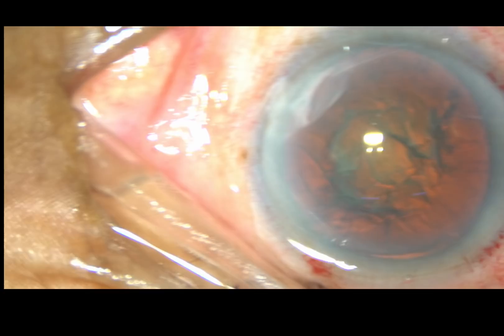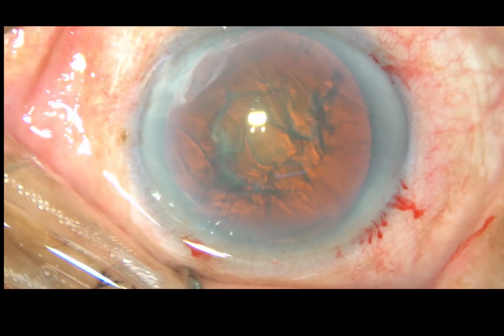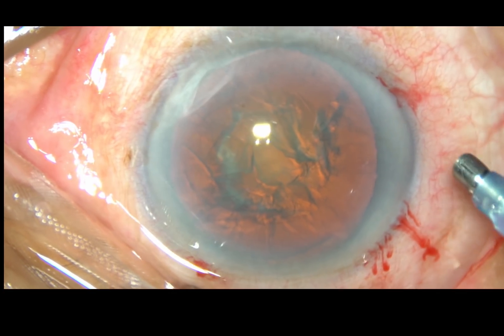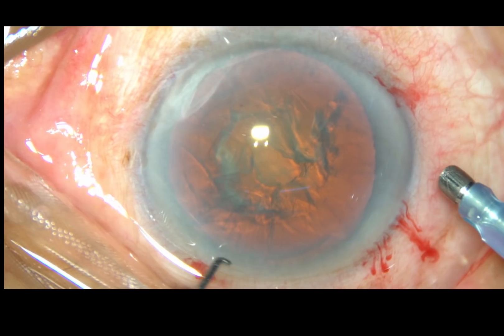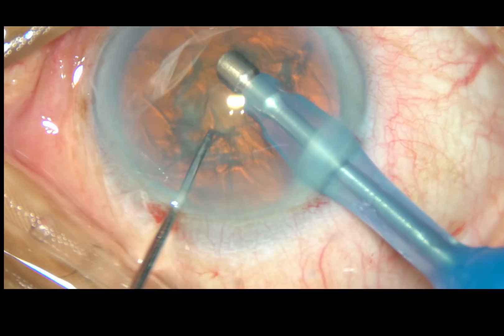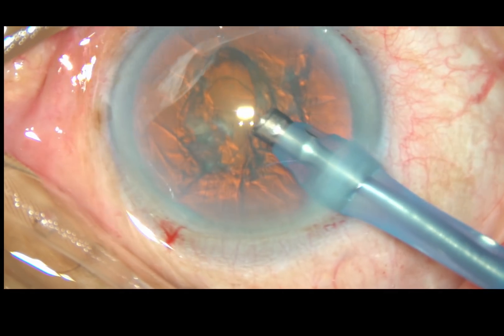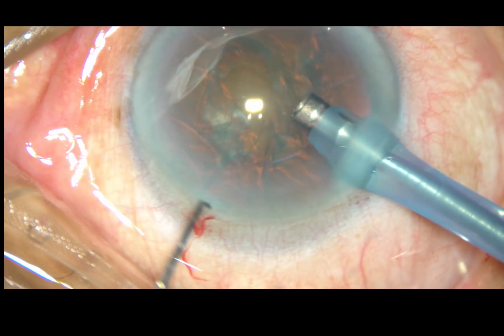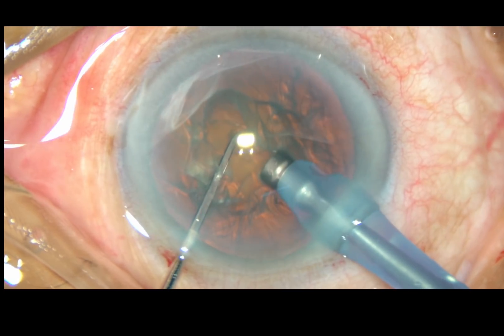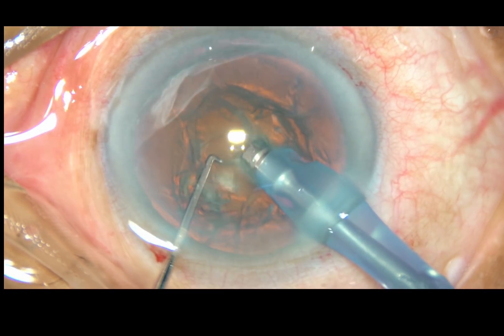You can see that the cataract is soft. Nuclear sclerosis will be about 2 plus in this case. I am thinking I may be able to hold this nucleus with low vacuum. I have set the vacuum at 350 mm of mercury and 35 ml per minute flow rate. Ultrasonic power being used is only 40%. I am making a small pit in front of the main incision and trying to hold it.